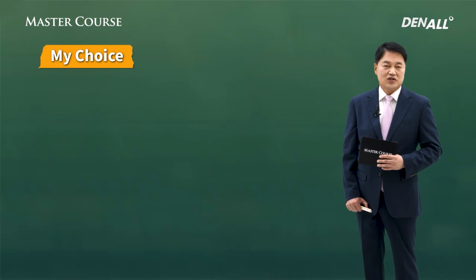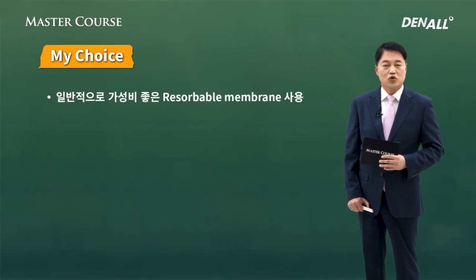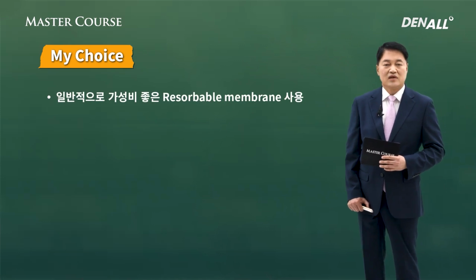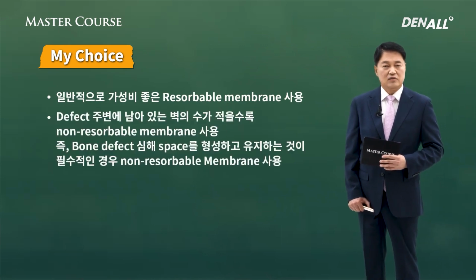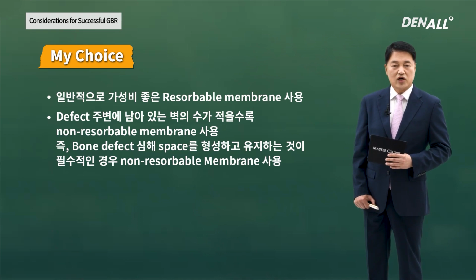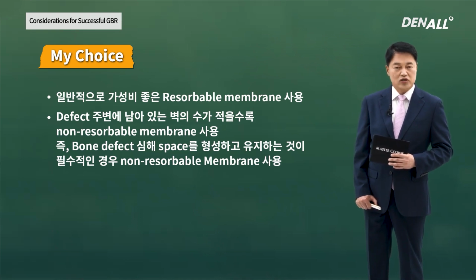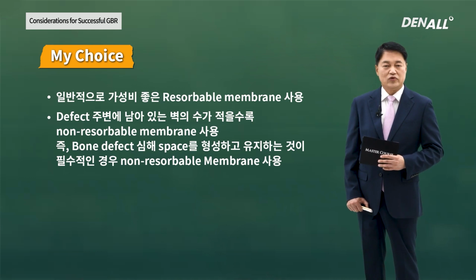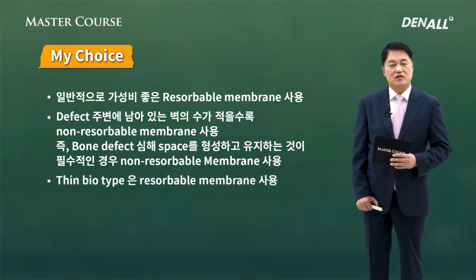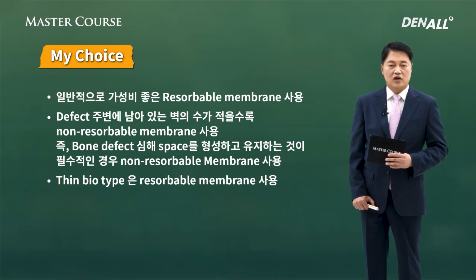The membrane that I use. I normally use resorbable membrane with good ROI. However, if the number of walls around the defect is very few, and if there is a very severe bone defect, and if it is necessary to create and maintain space, I use non-resorbable membrane. And for thin biotype, I use resorbable membrane because it has good biocompatibility and helps in preventing wound dehiscence.